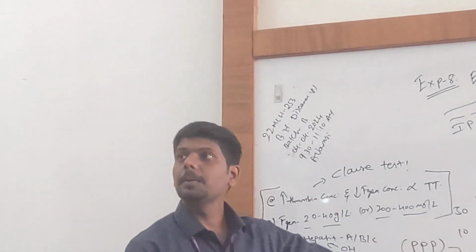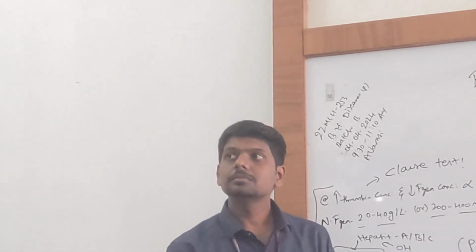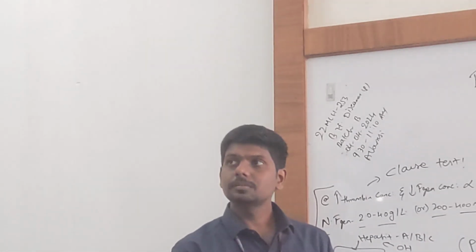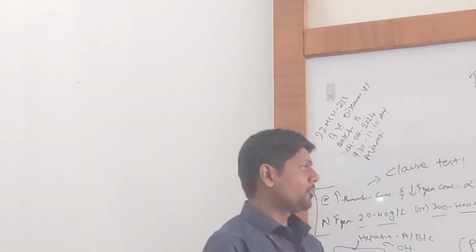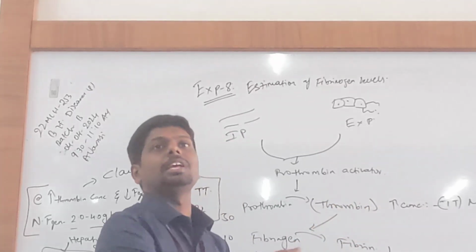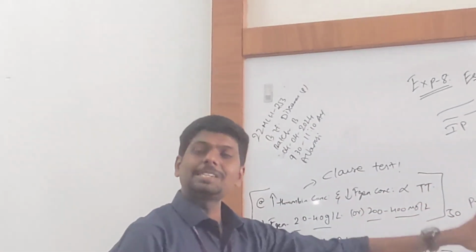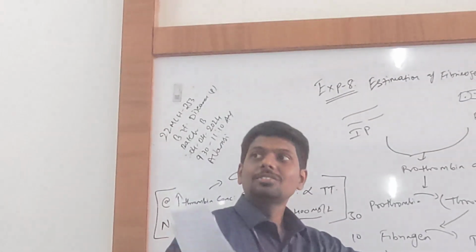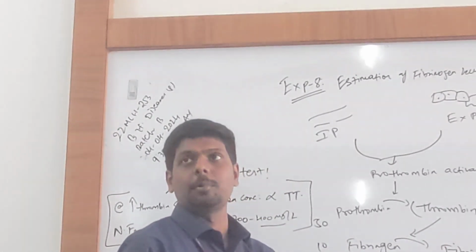Yes? Directly proportional to? Fibrinogen is low, correct. If thrombin time was increased, that means fibrinogen levels were decreased. That's why thrombin time shoots up. This test is particularly measuring low fibrinogen levels. Keep in mind, this test was particularly targeting low fibrinogen levels in the body.